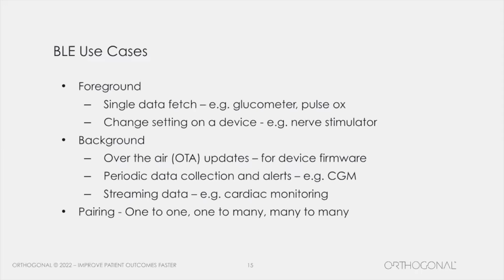And chip makers like Nordic actually have SDKs for doing that in a secure fashion that we often leverage for over-the-air updates.